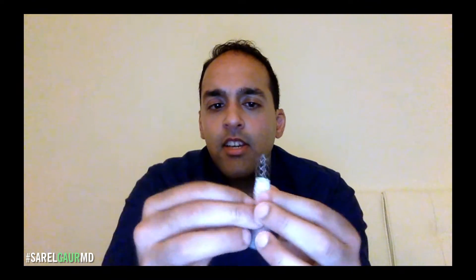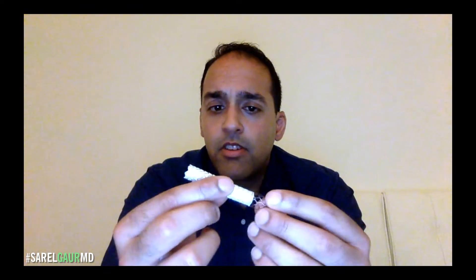This thing is so amazing and so robust. I can take this device, crush it up in my fist, and it just pops right back to normal. Let's go through methodically and talk about this stent. This stent is 10 millimeters in diameter — it's a 10-millimeter fake blood vessel — and 8 centimeters in length. You can see it has two portions: the uncovered portion and the covered portion. This is 2 centimeters, and this is 6 centimeters.